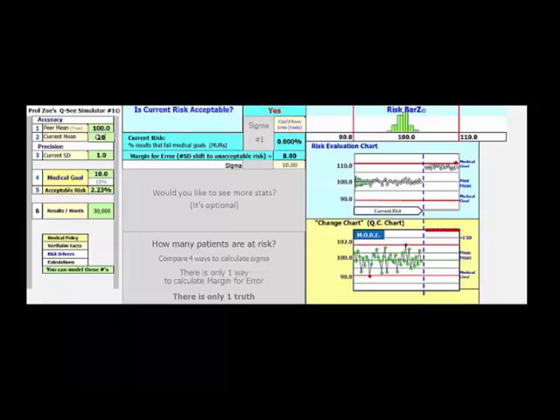Let me shift that up to 104. Now the sigma is 6, the margin for error is 4. We have a wider spread to the data. Let me shift it now up to 105. Now you're seeing that of the 20 points afterwards on the QC chart, there's one that's not flagged, but still 19 are. You'd probably see that in the first run.